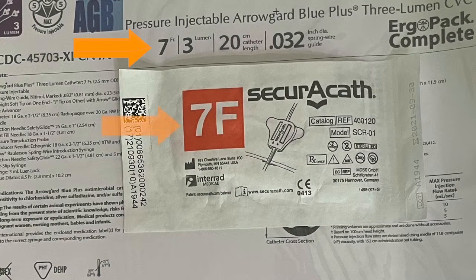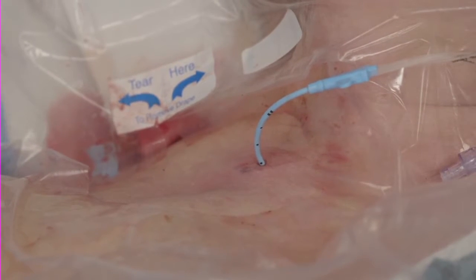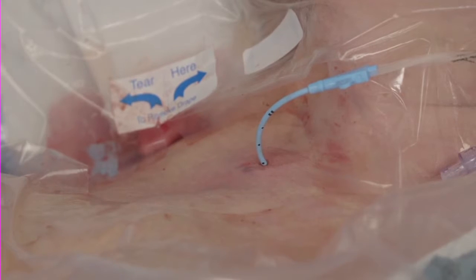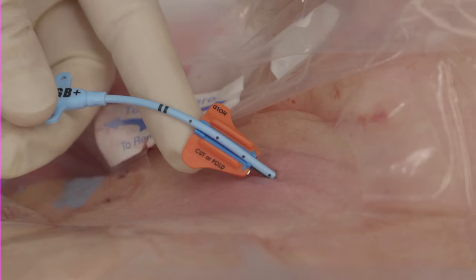Select the appropriate size SecuraCath to match the catheter diameter. Place the catheter according to protocol, leaving a minimum of 3 cm of catheter external to the insertion site. The SecuraCath requires at least 3 cm of catheter shaft to attach to the catheter.